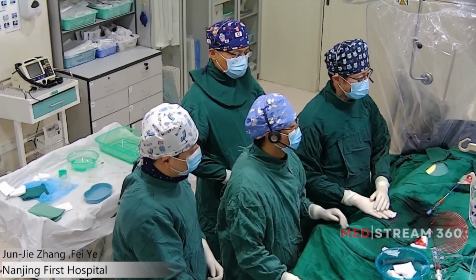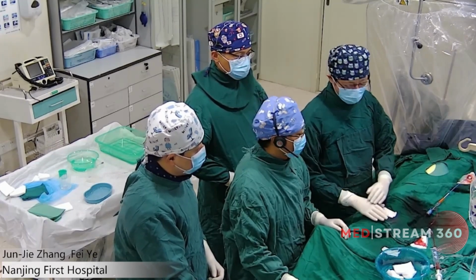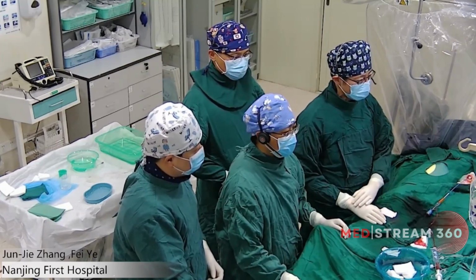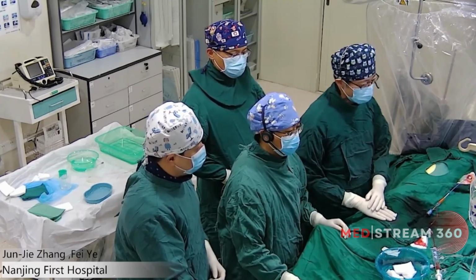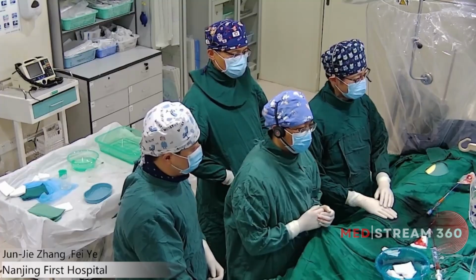Yes, we will perform a case of this left main bifurcation lesion. And my sisters are Dr. Li Xiaobo from 91st Hospital and Liu Shuiyuan from 91st Hospital. So, Dr. Li Xiaobo, would you please introduce the patient?